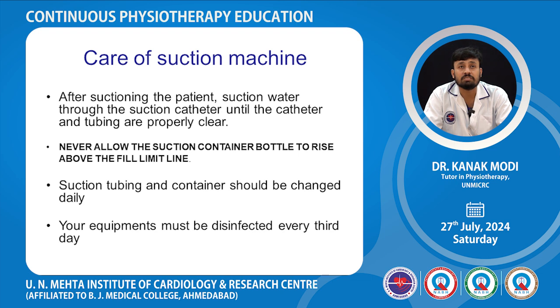Care of the suction machine. After suctioning the patient, suction water through the suction catheter until the catheter and tubing are properly clear. Never allow the suction container bottle to rise above the fill limit line. Suction tubing and container should be changed daily. Your equipment must be disinfected every third day.